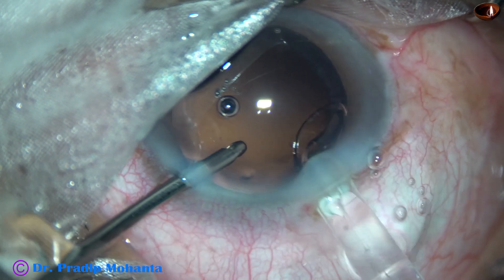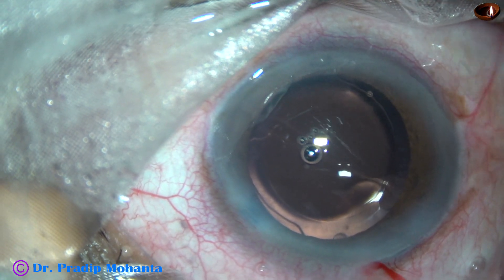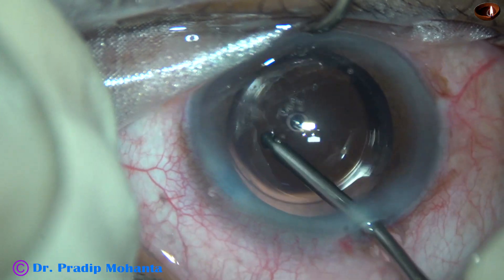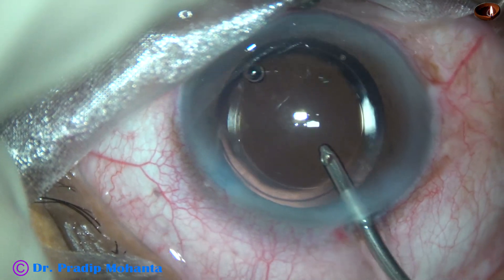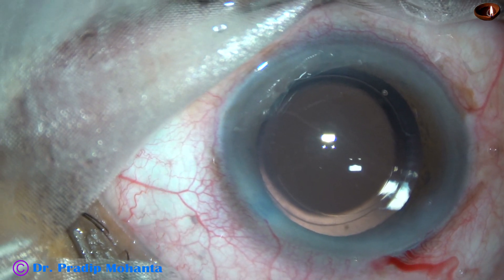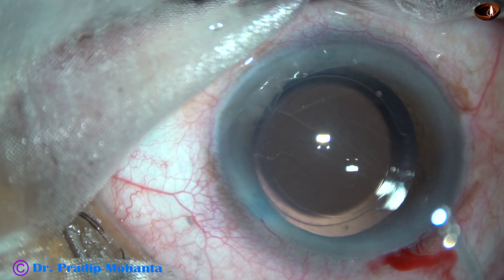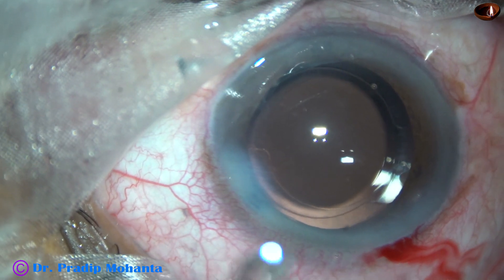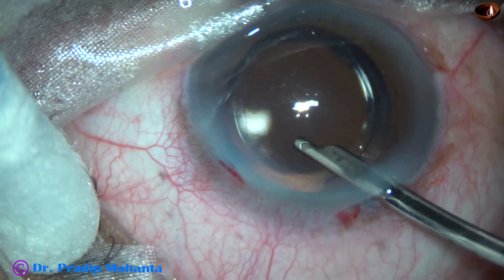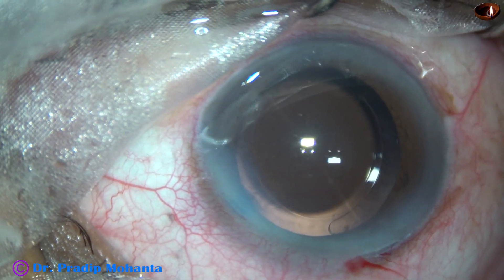Hydro-implantation of a single-piece monofocal intraocular lens is done in the capsular bag. This is the removal of the visco that is in the lumen of the cartridge. A bit of moxifloxacin is injected. The side port is closed by hydrating the corneal stroma on either side of the wound. The main wound doesn't require any hydration when the wound is made in this way.